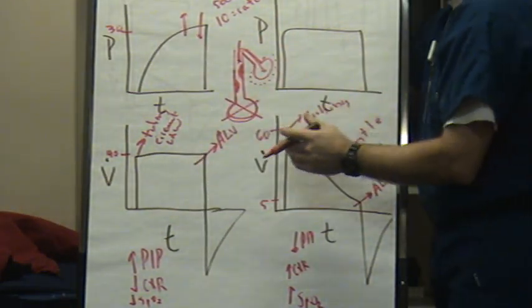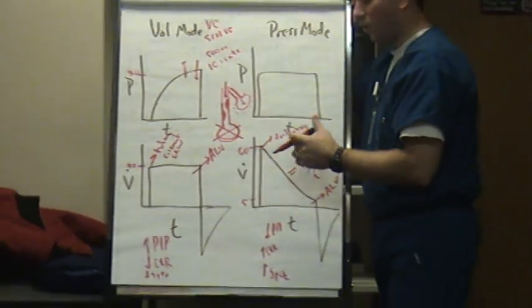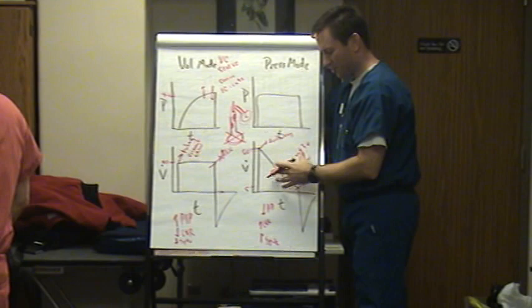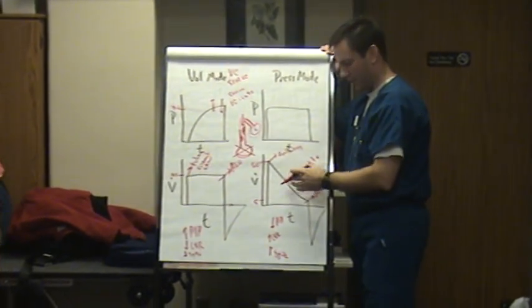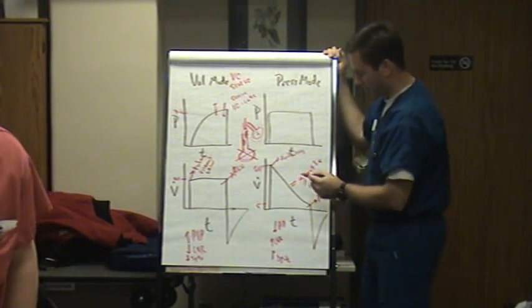You want to know that if you have a healthy lung individual, you want to know what their tidal volume is, and you want to know what their minute volume is. But when you flip that switch and this flow becomes decelerating, it's so much more gentle to the patient. So keep that in mind.